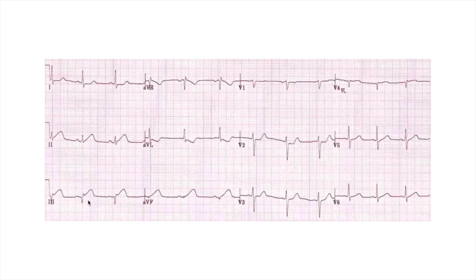Then I would go on to P waves, they're present. No, there's no PR elongation. Q waves, QRS is not broad, and widespread ischemic changes. So this is indicative of an inferior STEMI or ST segment elevated myocardial infarction.